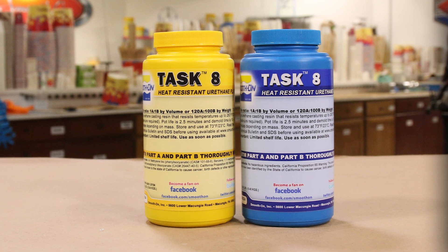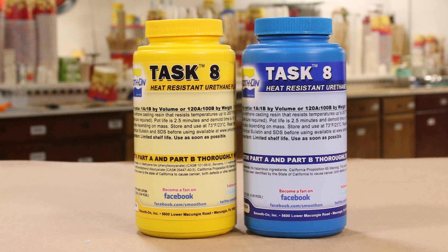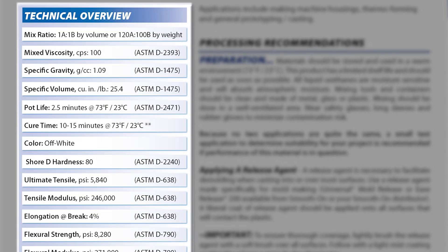For the castings, we're going to be using the Task 8. This is a heat-resistant urethane resin, and the reason we picked this product is in anticipation of it withstanding the temperatures of going into an autoclave to be cleaned. These masks are made with the intention of getting cleaned, and the material will withstand the high temperature of that autoclave.